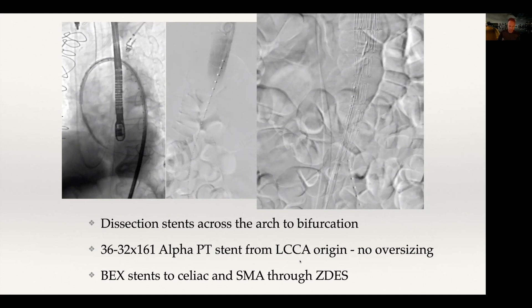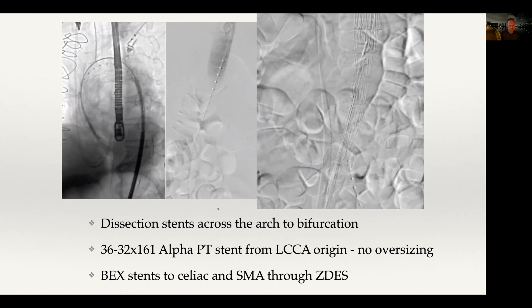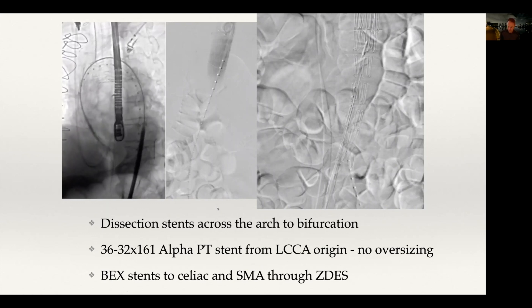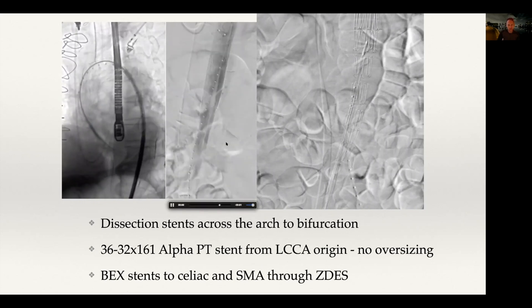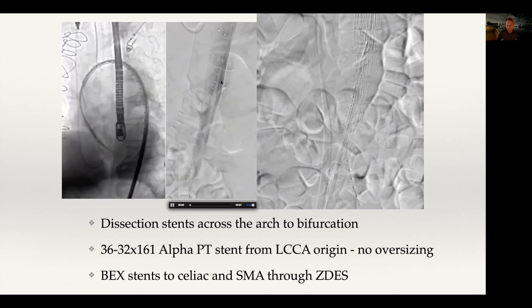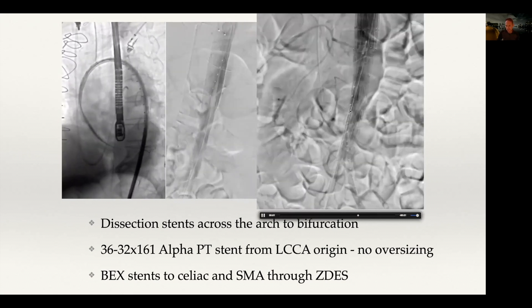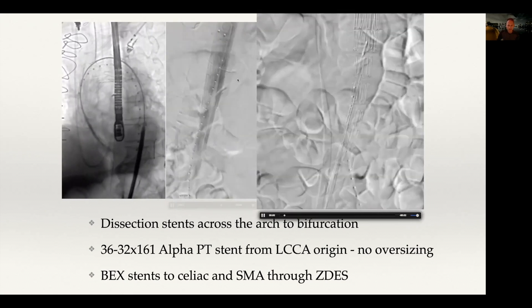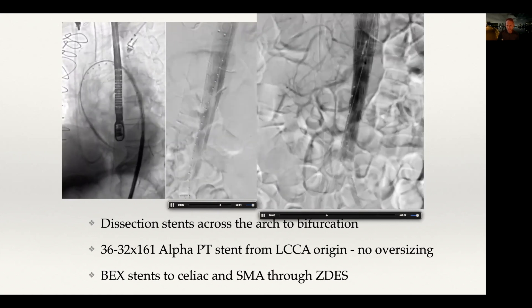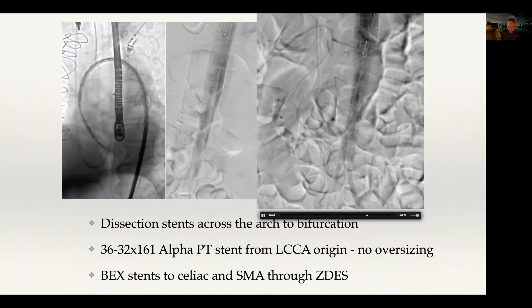Balloon-expandable stents were placed into the celiac and SMA because of how compromised they were. You can see the dissection stent opening up across the aortic arch, expanding the true lumen. The covered stent was placed distally to the carotid without pressurizing the dissection into the arch vessels. Angiography showed very little initial flow to the visceral vessels — not uncommon in extensive dissections. After stenting the celiac and SMA, perfusion to both improved dramatically, and the kidneys were also perfusing, though less visible on the rapid angiogram.